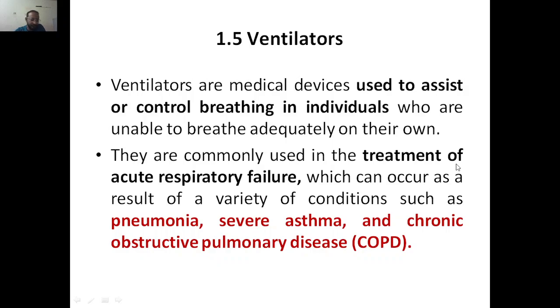So today we are going to discuss ventilators. So far we discussed the lung, an introduction to the lung and its function, and we discussed the architecture of the lung. We discussed the gas exchange mechanism of the lung. Then we discussed the abnormal physiology of the lung and COPD. In this class we are going to discuss ventilators.